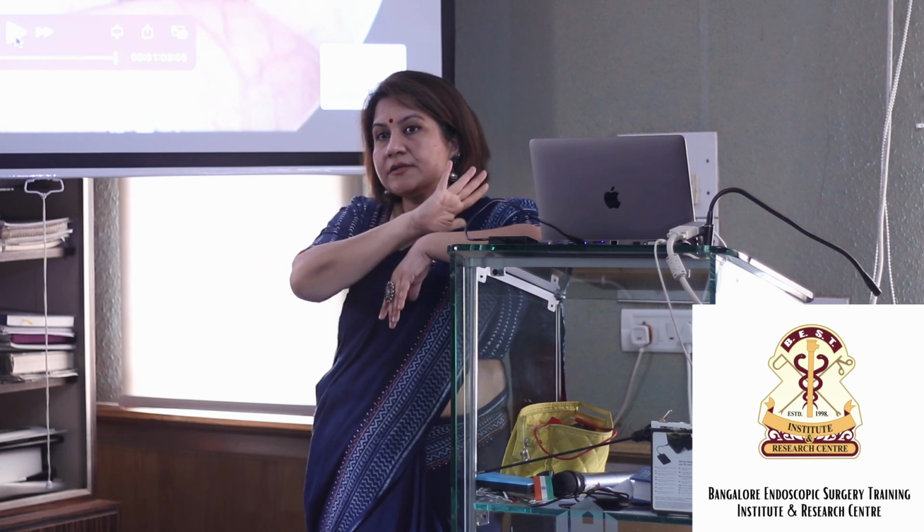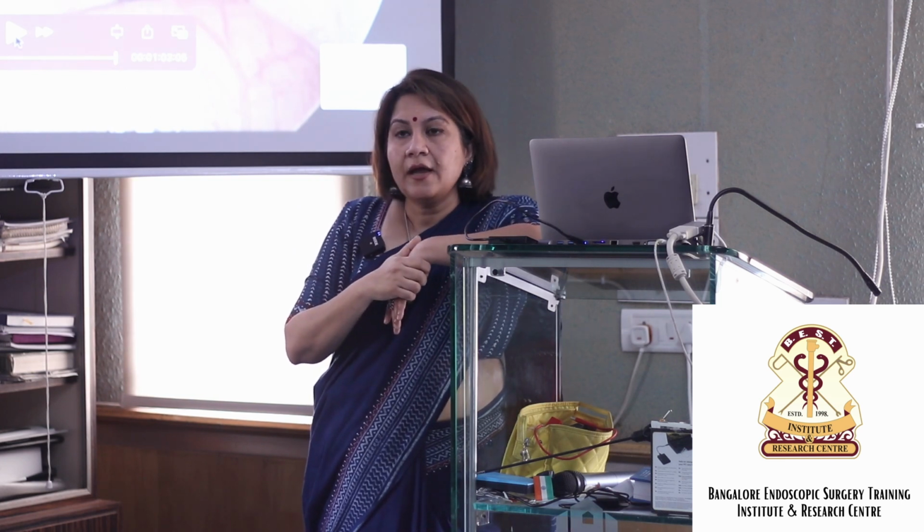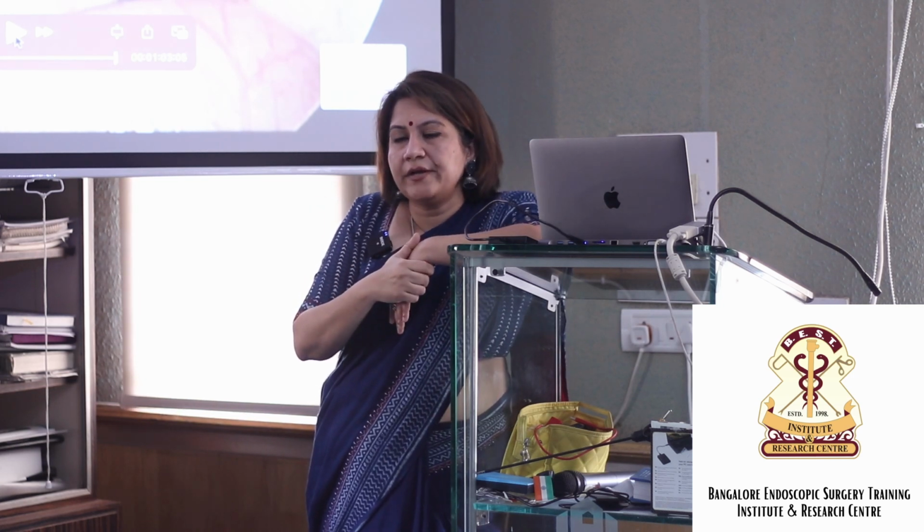If the tubes are looking very bad, tubal perforation. So the only time when your tube perforates is with a very rigid os. And see here, you could see the opening of the ostium with the polyp. There are times when it's completely black and you don't even know where the ostial area is. It's a little bit of guesswork you'll be doing over there. And when you push the guide wire thinking that could be the area of the os, you will end up perforating, and you will nicely see it on laparoscope. But then you know how thin it is, so it's not a big deal. It won't do any harm to the patient. It's just a failure of the procedure.